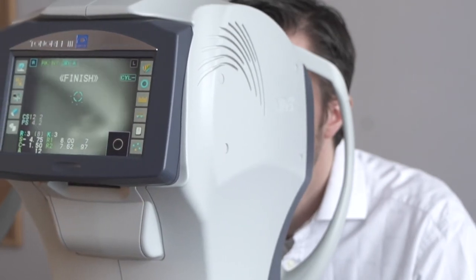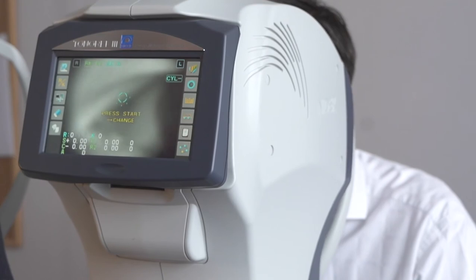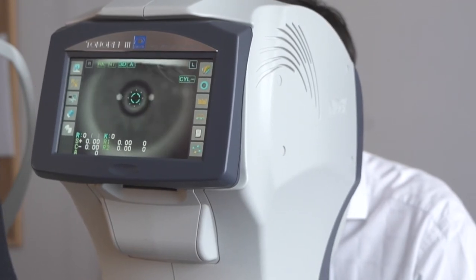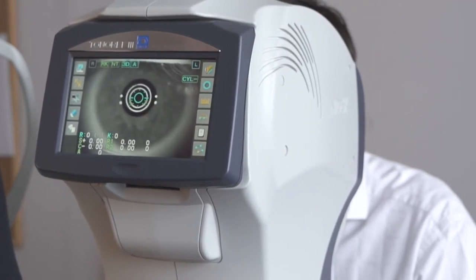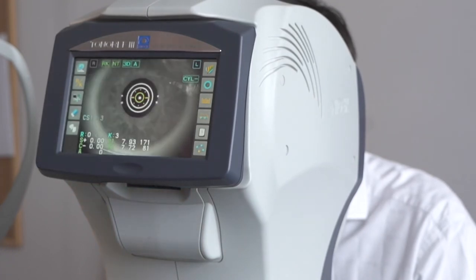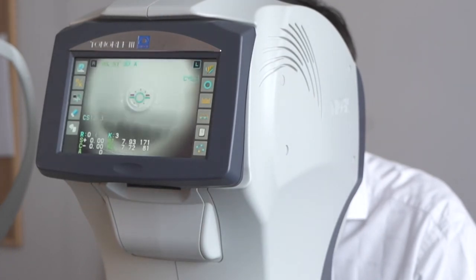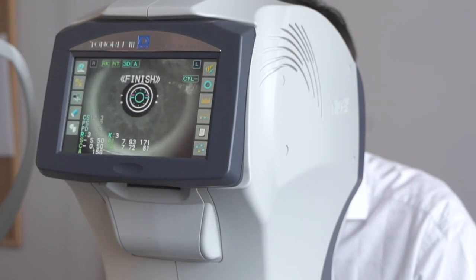Once one eye is complete, come over to repeat the other eye. Again, just line up with the center of the pupil, push the machine forward until you've got yellow on the screen. Get the patient to look straight towards the hot air balloon while it takes the measurements.